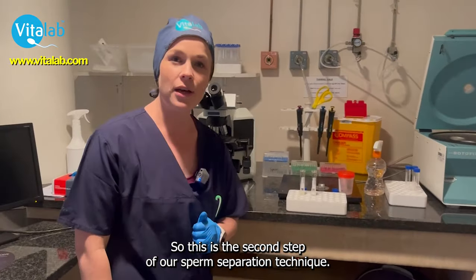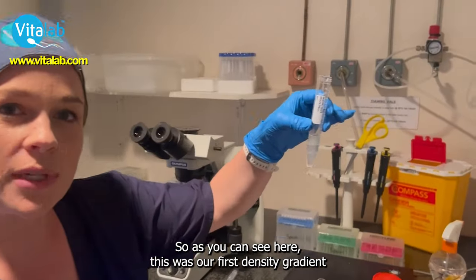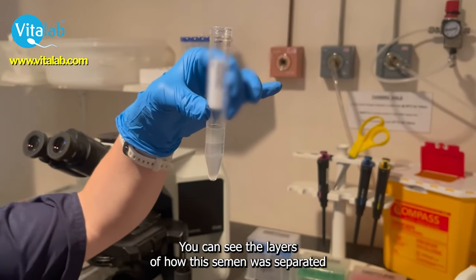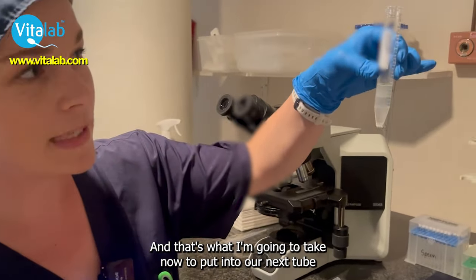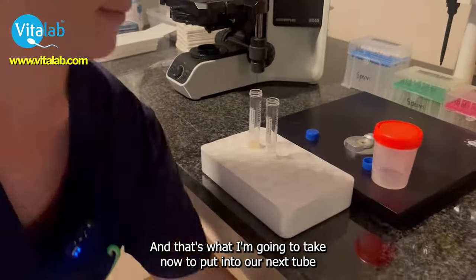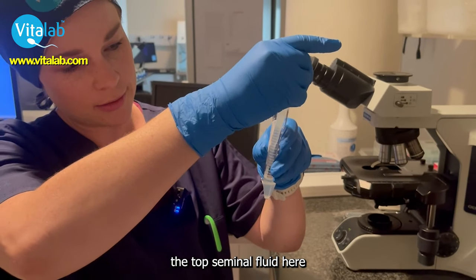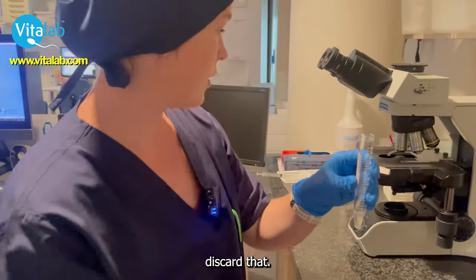So this is the second step of our sperm separation technique. As you can see here, this was our first density gradient — you can see the layers of how the semen was separated, and this is exactly what we want. We want the little pellet there at the bottom, and that's what I'm going to take now to put into our next tube. I'm just going to aspirate the top fluid here and discard that.